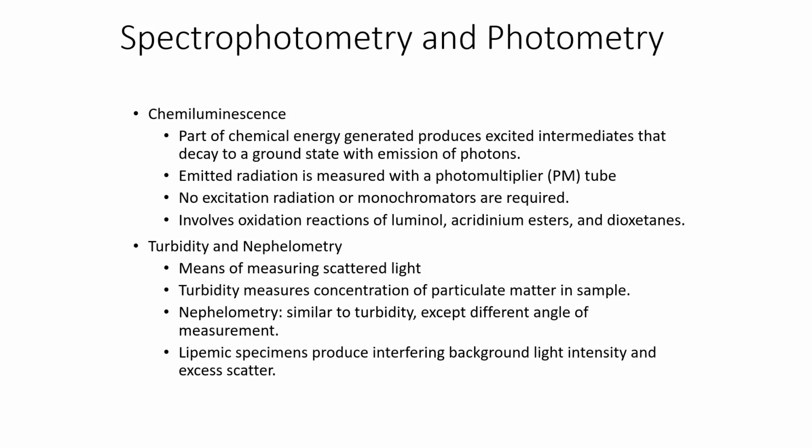Turbidity and nephelometry, means of measuring scattered light. Turbidity measures the concentration of particulate matter in a sample. Nephelometry is similar to turbidity, except it's a different angle of measurement. Lipemic specimens produce interfering background light intensity and excess scatter, so that's going to mess with these readings.